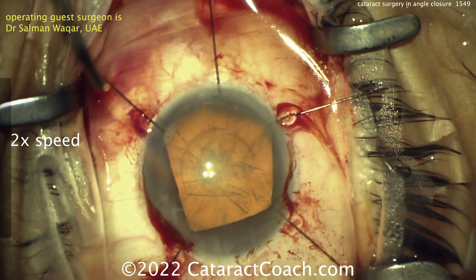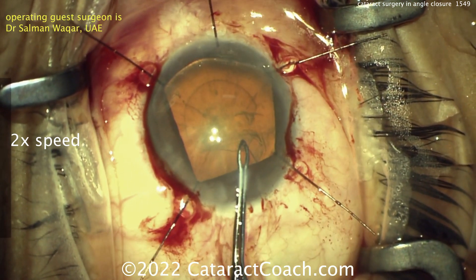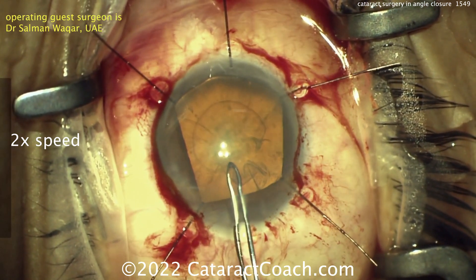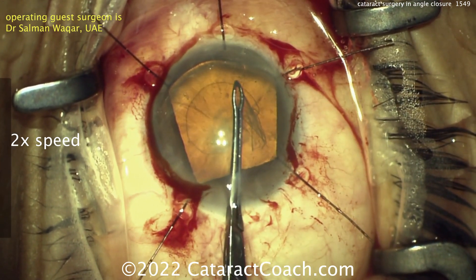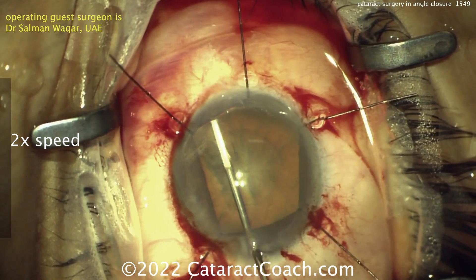A good rhexis is going to be key in this case. I love the idea of refilling with viscoelastic there, creating more space. That viscoelastic fill is going to be a temporary thing. I'd probably still just use my traditional dispersive viscoelastic, being very cautious not to distort the incision, and maybe refilling a time or two like it's done here. The rhexis has now been done — just make sure it's not a baby rhexis.